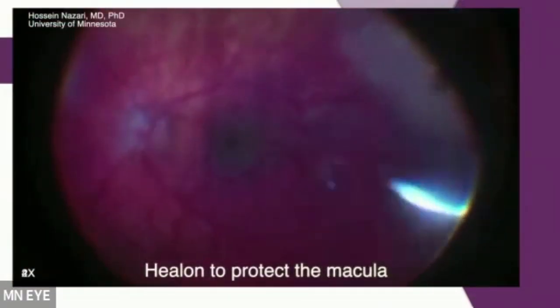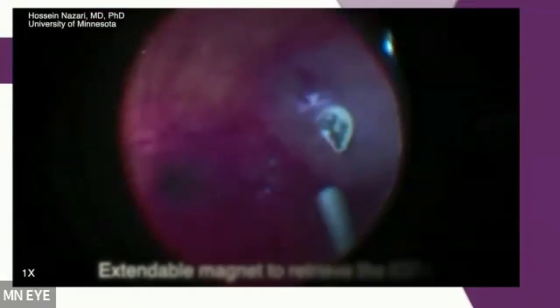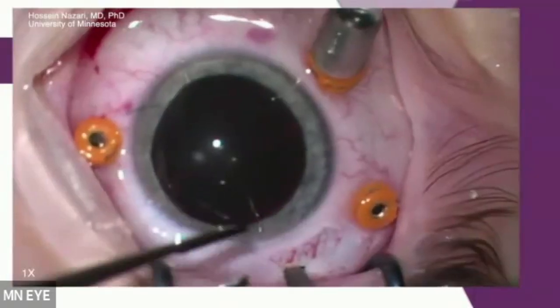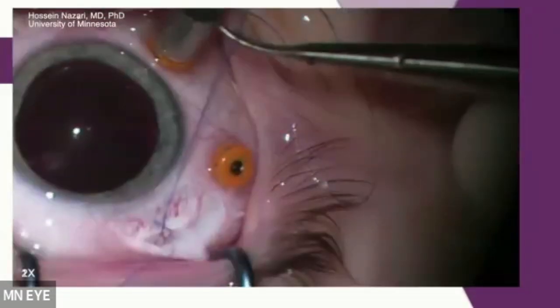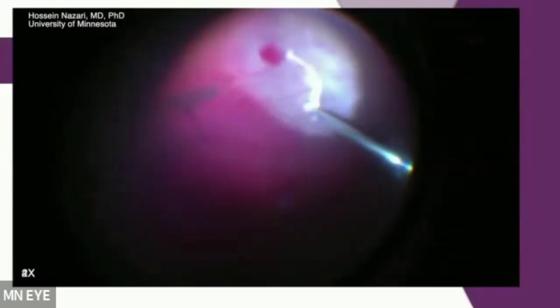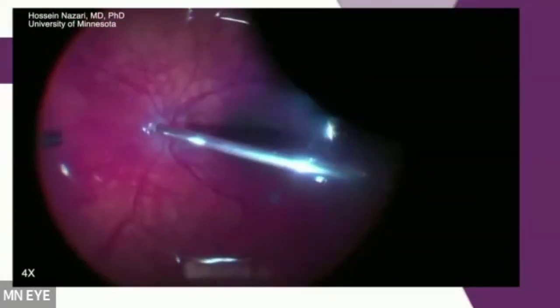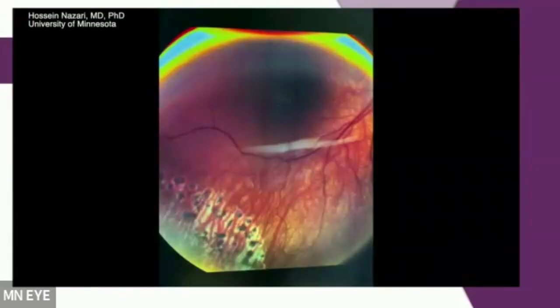However, there were whitish infiltrates around it. So I put the Healon in the posterior pole just to protect the macula when I remove it. This is a magnet that helps me pull the foreign body out. This is not huge, but huge for the eye. And then you see that the retina is starting to become infected, retinitis. There's a whitening beyond the impact site of the foreign body. I put good laser, and then thinking about the infection, I put oil in the eye.